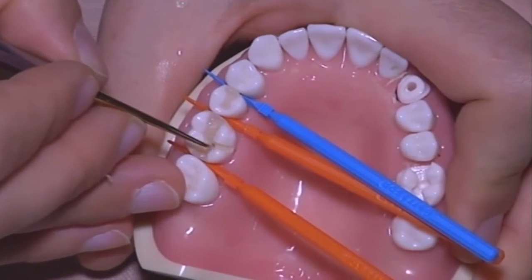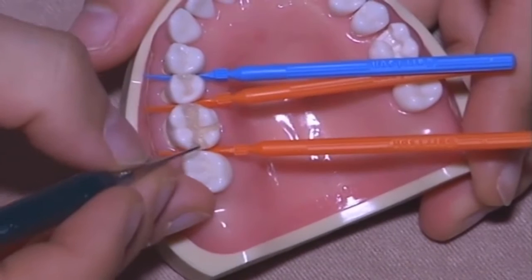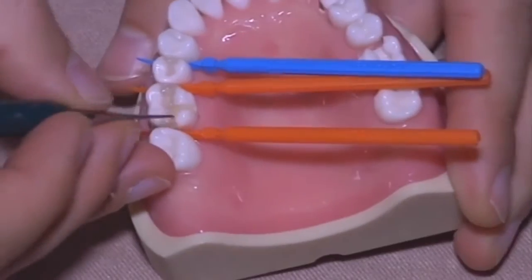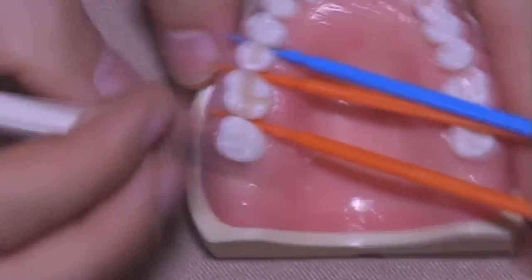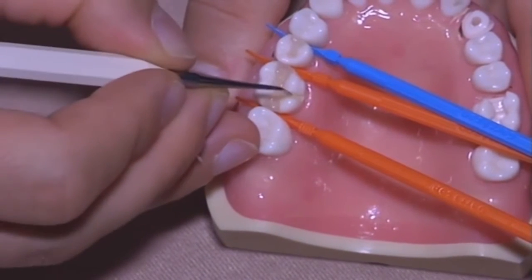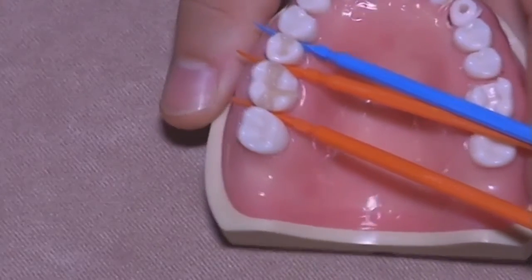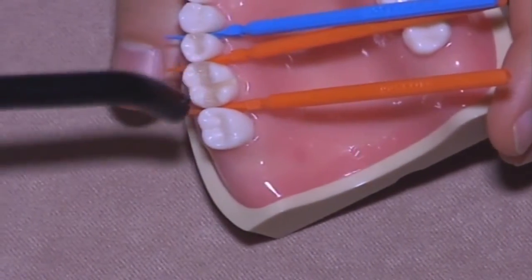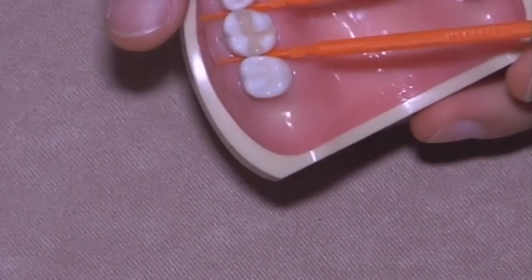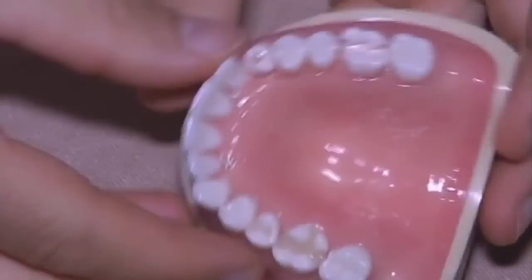And we are gonna already give anatomy. Here we are. And we have the dentin shades. I can remove this. I think it will not bleed.